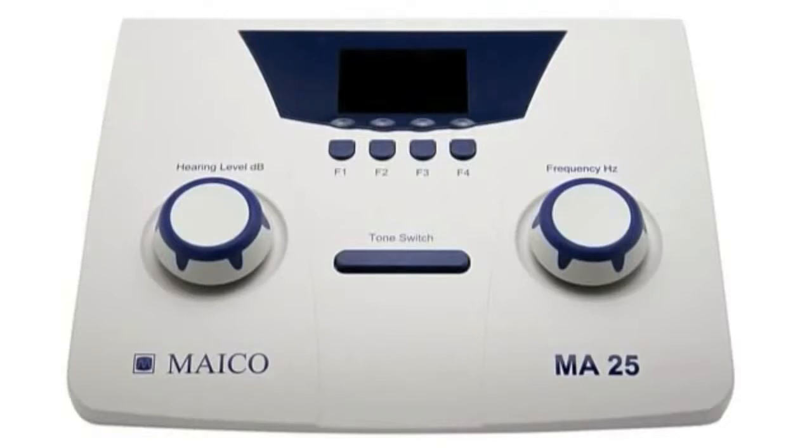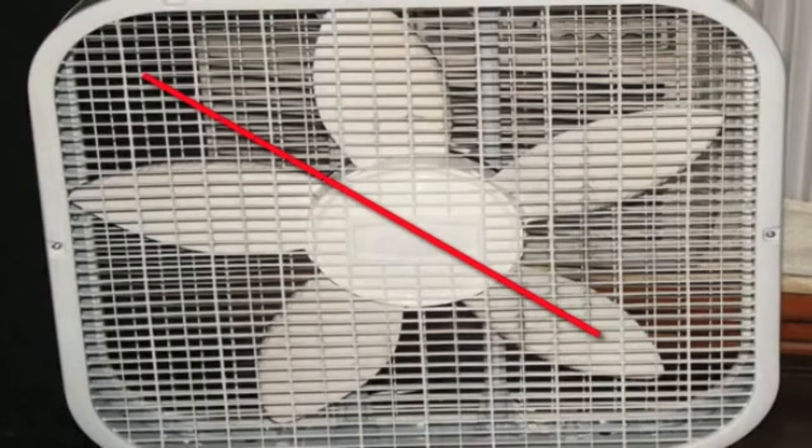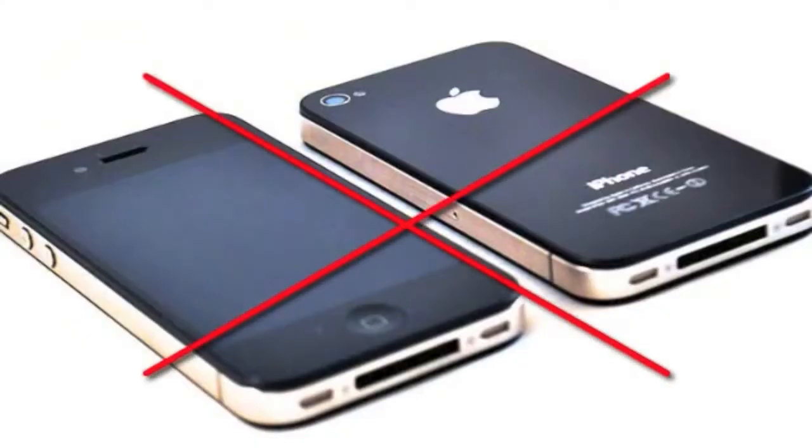Okay, let's get started. Make sure that you are in a quiet room away from external noises and distractions. Try to make the room as quiet as possible by turning off all sources of noise, including fans. The tester should set the audiometer on a table and have their own chair oriented so that they can easily operate the audiometer. A second chair should be set up for the child.